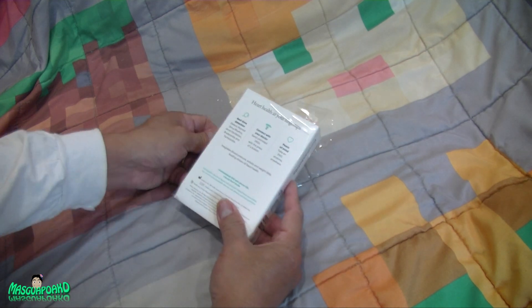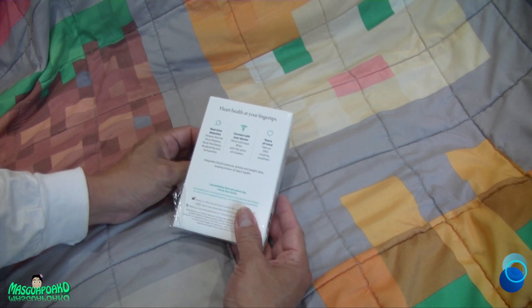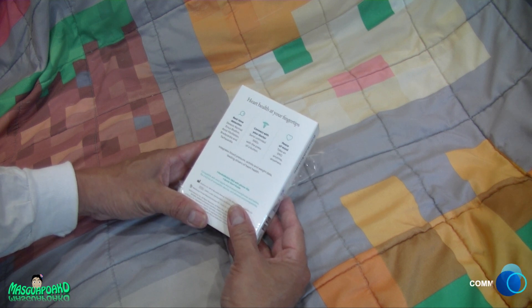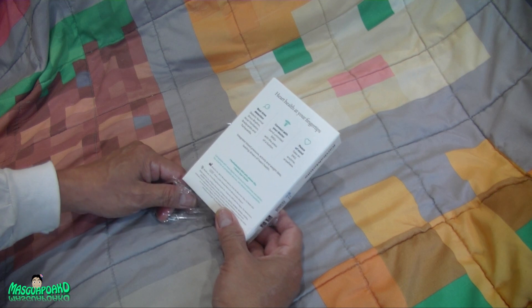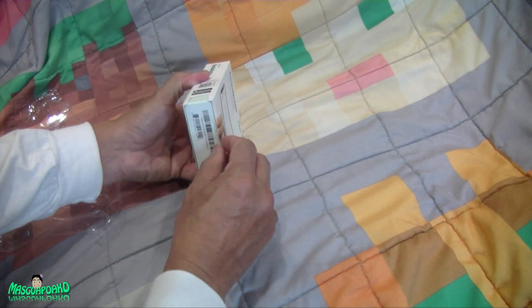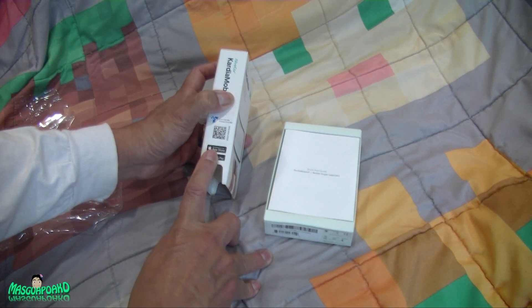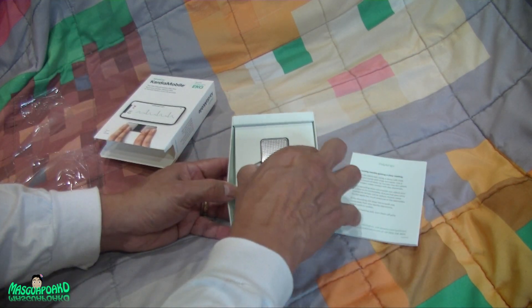In the box it says 'heart health at your fingertips' — real-time detection. It detects normal sinus rhythm, atrial fibrillation, bradycardia, and tachycardia. Connect with your doctor, send unlimited EKGs with the press of a button, peace of mind, take the EKG anywhere at any time. This thing works with Apple iOS or Google Android.